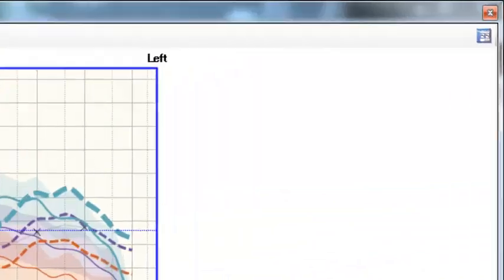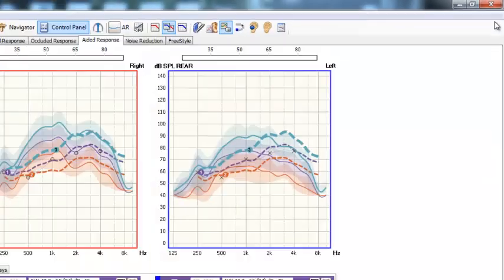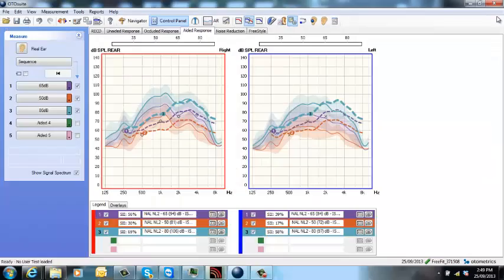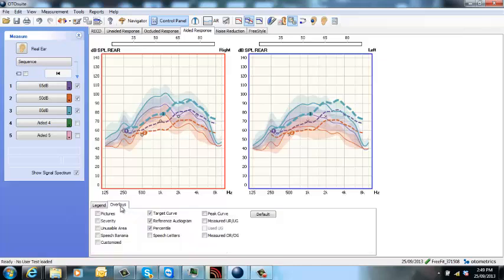So once you've finished and matched the target—which I know I haven't done in this instance—you can go back to full screen mode. Now you might think this screen is now very busy. That's okay. If you just go to this overlays box at the bottom, you can get rid of that percentile.